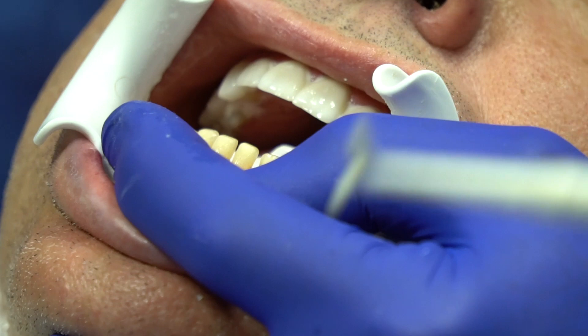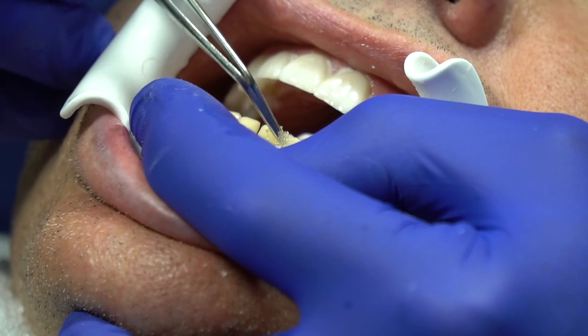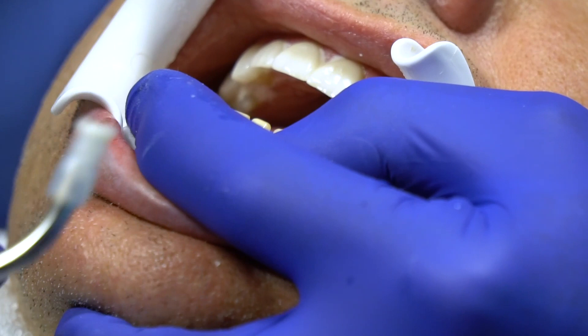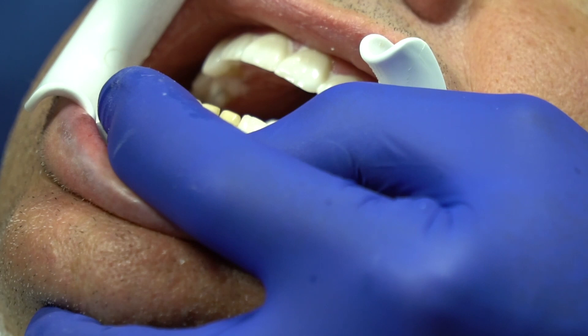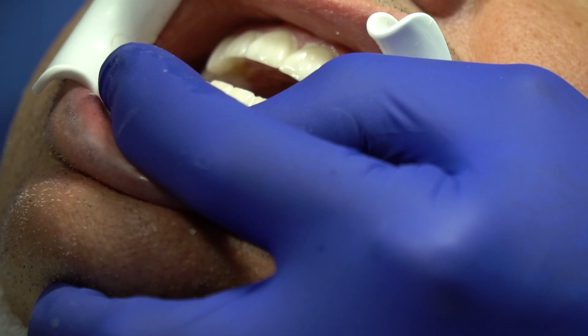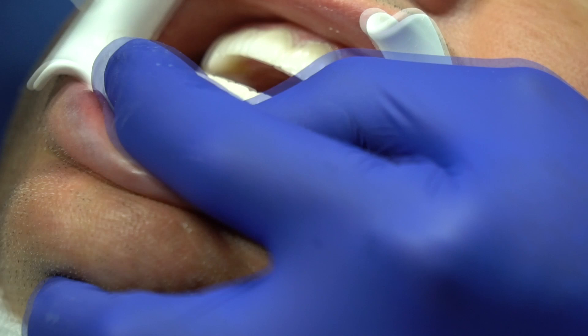What happens if Randy right now decided to cough? I would just blow it off, add more Tenure S, and go — I would not back up, re-etch, or do anything else. We're going to look and check for bubbles — none, good. When we seat these down we want to make sure cement comes out at all the margins — gingival, incisal, all margins, we want excess. I'm not going to use matrix strips because there's not enough tolerance in the contacts. Everything looks pretty good, they're down. Tack everything, clean up, wipe off the excess.